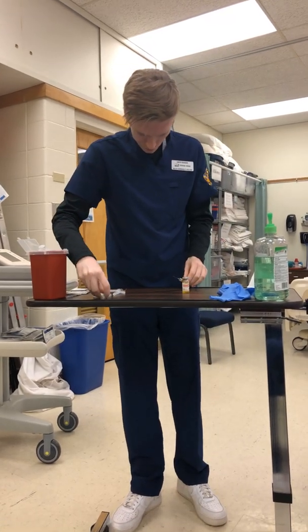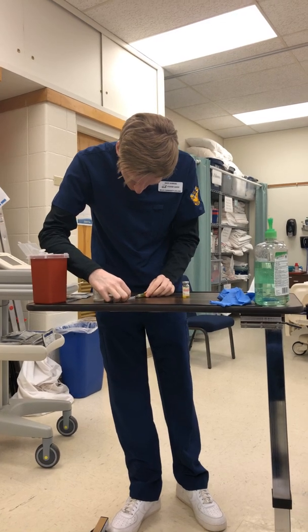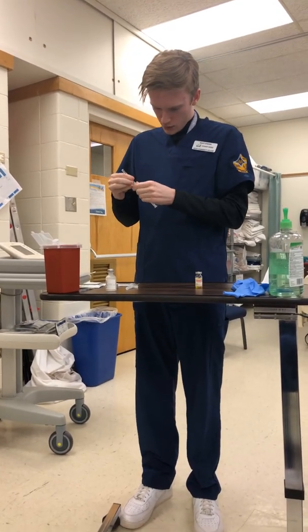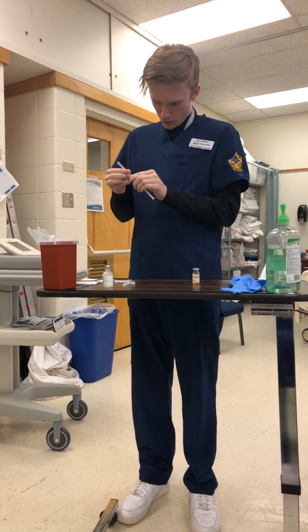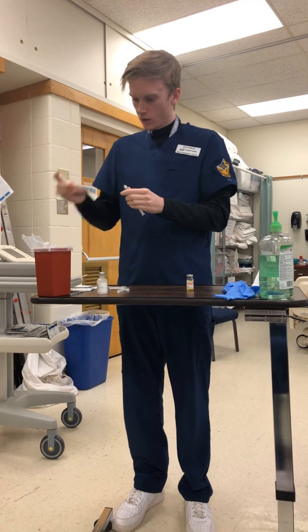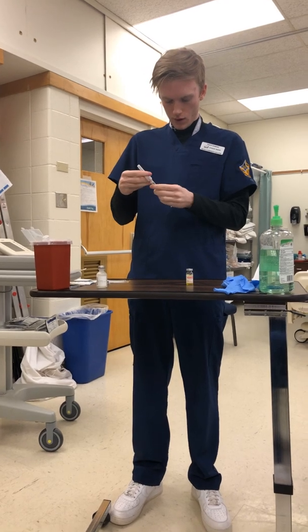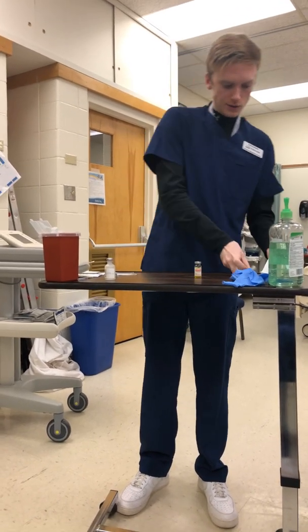There. Recap that. It's not coming off. Discard of that, and then replace the previous needle that was on there. And now we are ready to begin.